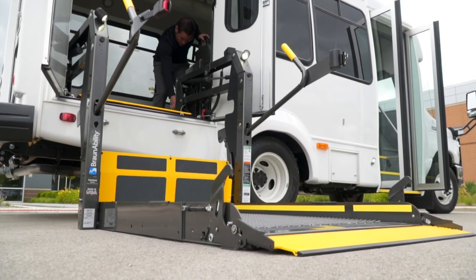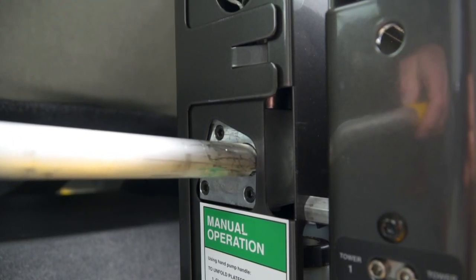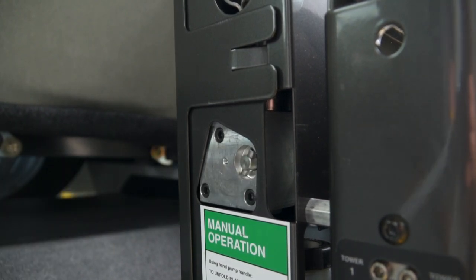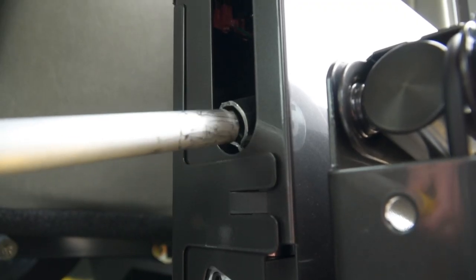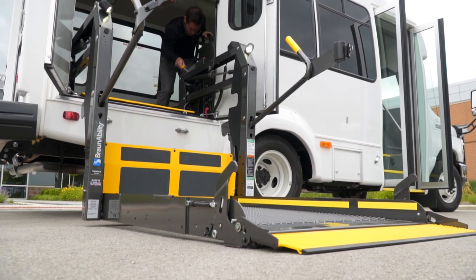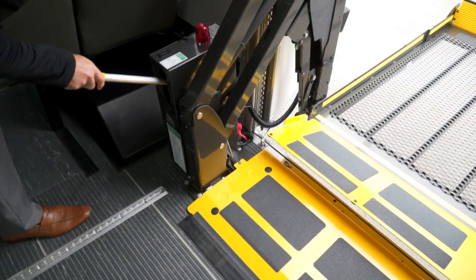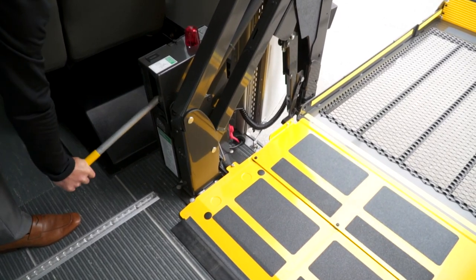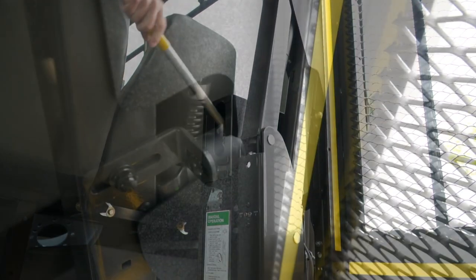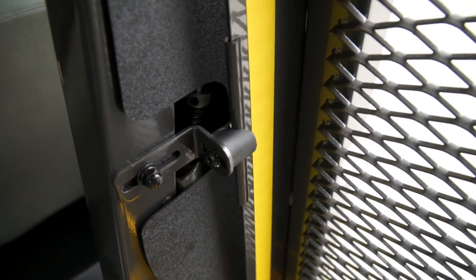To manually raise the platform and return it to its storage position, close the release valve by placing the slotted end of the pump handle onto the backup pump release valve and turning clockwise. Then insert the handle onto the backup pump receptacle and stroke until the platform reaches floor level. With no passenger on the platform, you can continue to stroke until the platform folds fully. Be sure that the release valve remains closed and ready for automatic operation once power is restored. Be sure to return the pump handle to its storage clips.